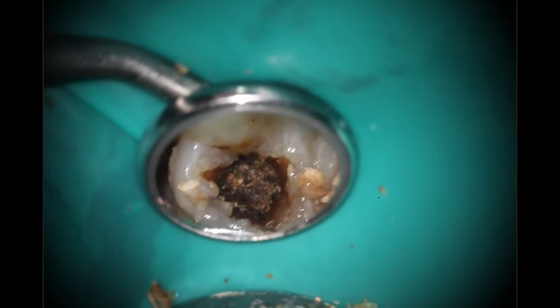First things first, let's get that caries out of there. With a broken down tooth like this, I still like to take it out of the bite using that wheelbar. That's the first thing we're always going to do. I just don't want to have any issues with this tooth breaking down in the interim.